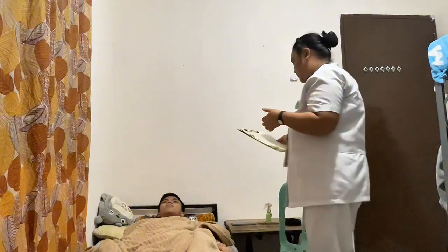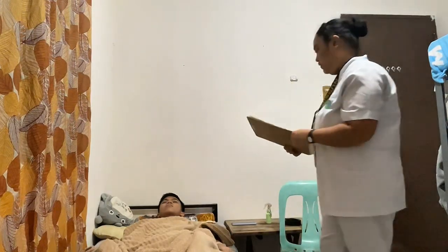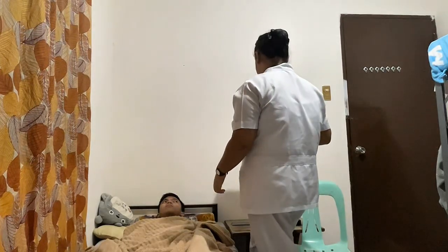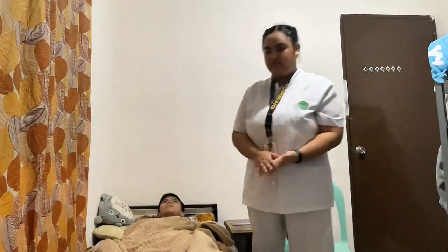So next is, since I already adjusted the height of the bed to the lowest position, I will slowly raise the head of the bed if not contraindicated. But since I do not have an adjustable bed, and the patient is already comfortable with the position, I will now proceed to the transferring of the patient. So first is to adjust the legs of the patient.